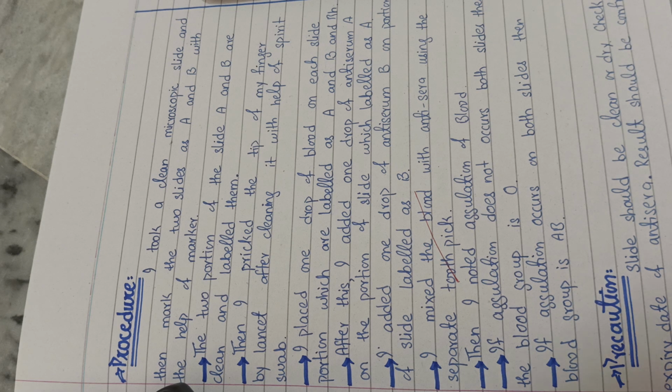Then you have to prick your finger and place drops of your blood onto this slide, and after that you put the anti-sera A and anti-sera B on these blood drops, and then mix them with separate mixing spatulas. Then you wait for some time, and after some time agglutination will occur, and where agglutination occurs, you will find out your blood group.